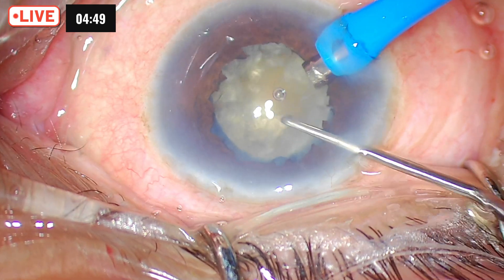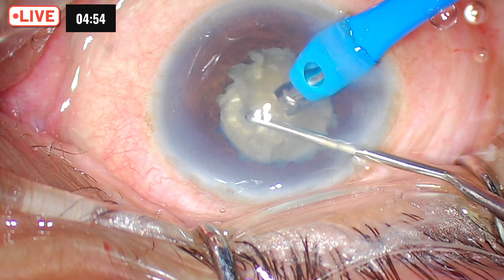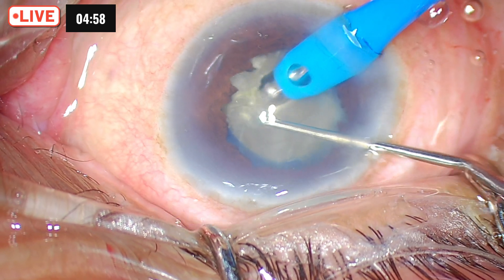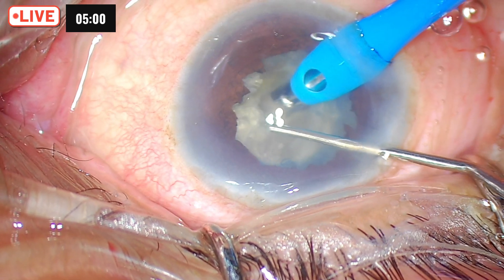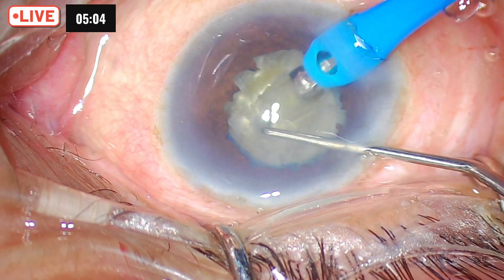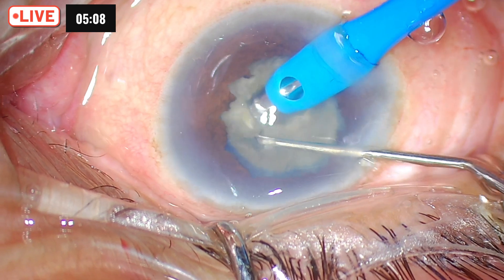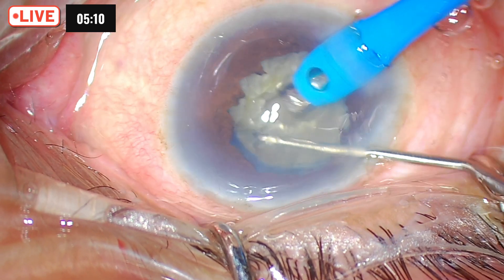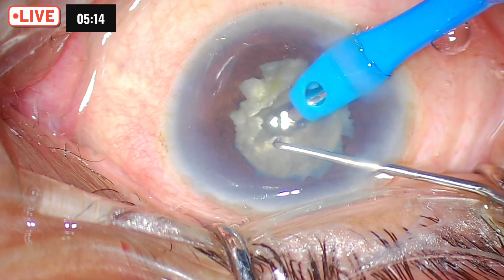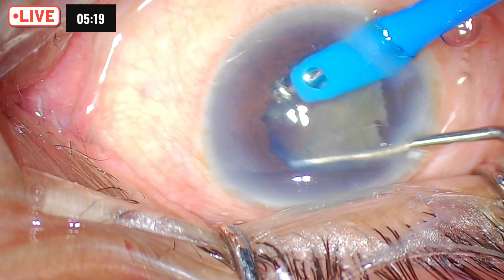We also have a floppy iris, zonular weakness, and a supermature cataract. The trick in such cases is to aim in the center — you have to divide the center, which is the hardest part of the nucleus. So I am creating a trench in the center. Once the trench is created, as you near the iris, be careful because the iris is floppy and you might end up catching the iris. And there we go — deep into the cataract and split it.